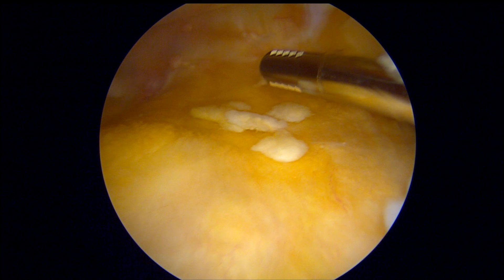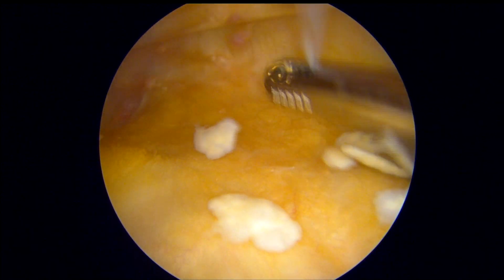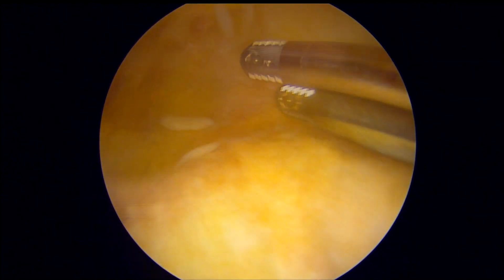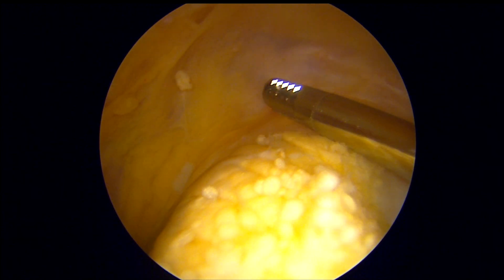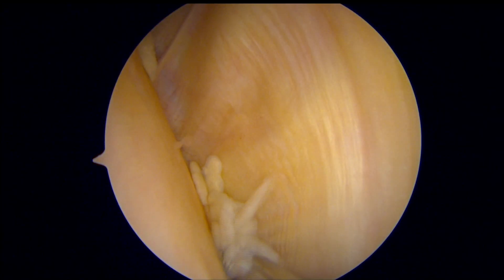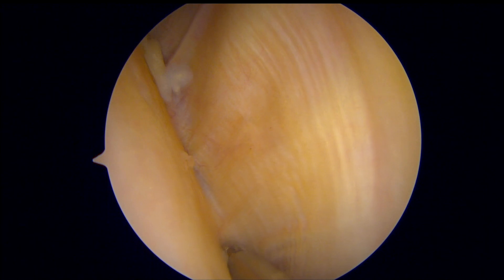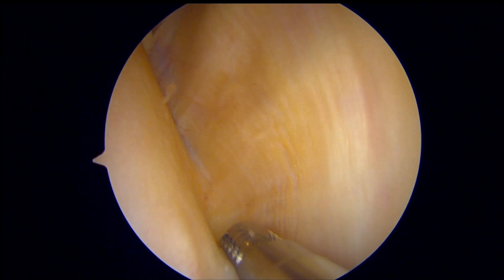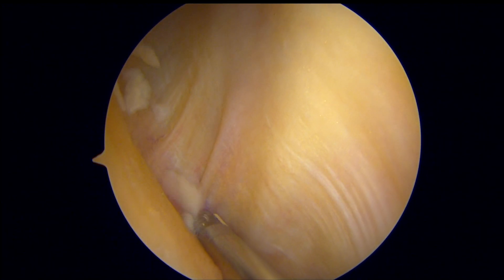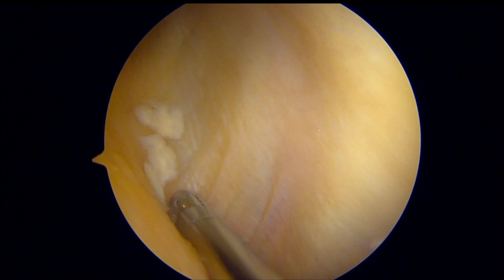The arthroscope is now introduced into the suprapatellar pouch, where you can again see multiple cartilage loose bodies. Here is the medial gutter, with multiple loose bodies composed of cartilage, and the arthroscopic shaver is being utilized to remove all of this cartilage debris.